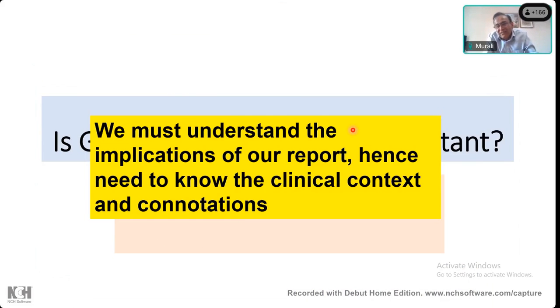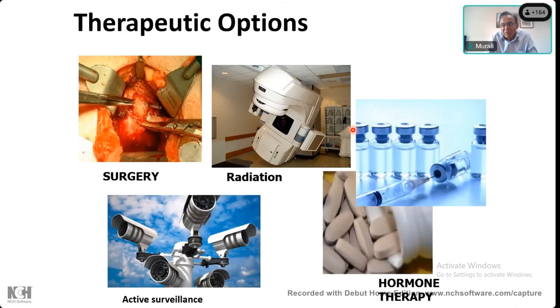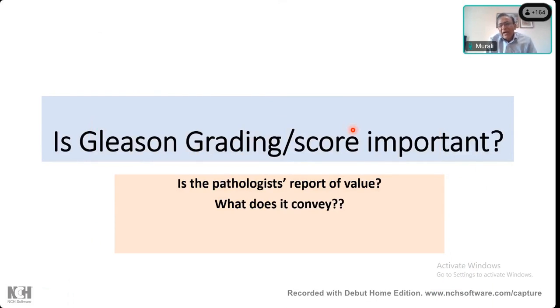So the reason I'm saying this is when you have a large amount of tumor, it doesn't matter what your percentage is. The percentage only matters when you have a small amount of tumor. Right? The problem with the percentage is that you have a numerator and a denominator. A 3 millimeter tumor in a 4 millimeter core is not worse than an 8 millimeter tumor in a 20 millimeter core, even though the percentage will be much higher. Okay, so I think the only thing I would say, Santosh, is don't worry too much about the percentage.